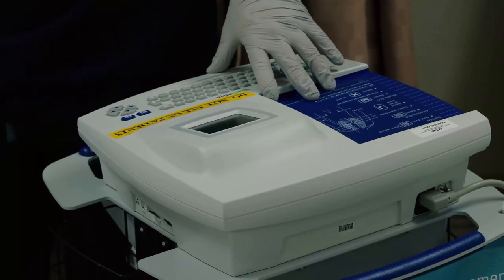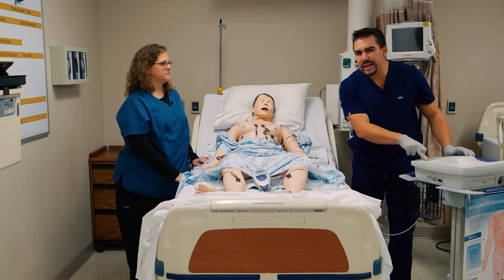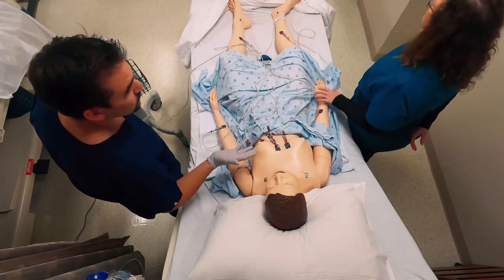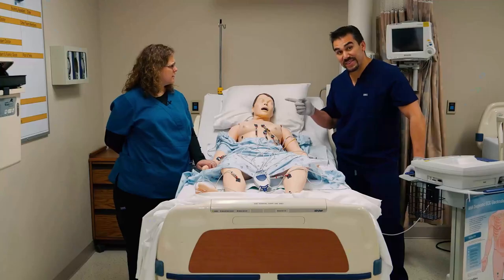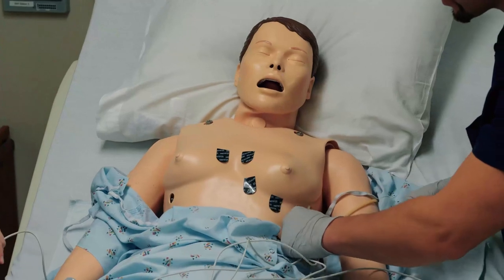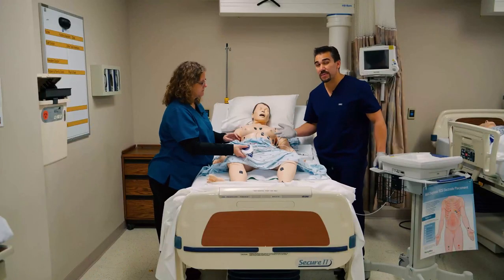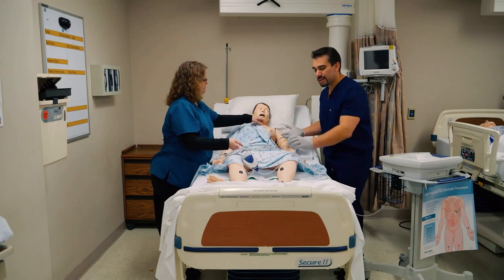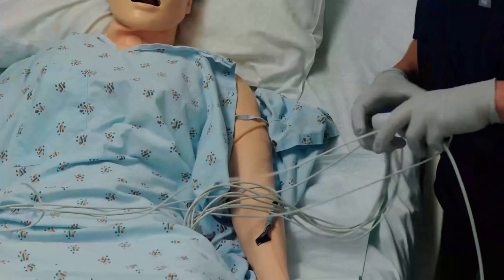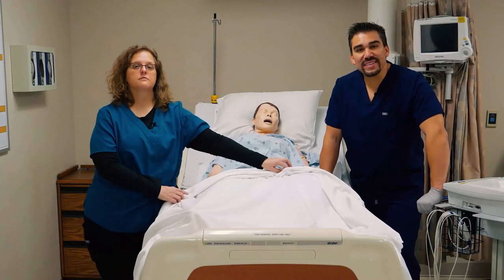Once everything is in place, tell the patient to take a big deep breath out and try to stay as still as possible. Depending on the machine, it takes three to ten seconds to get a good reading and then starts printing. Leave the EKG stickers on during the ER stay — the doctor will usually reorder the EKG later. When a patient comes in with an MI, we do multiple cardiac enzymes like troponin as well as multiple EKGs to see if the patient is getting better or worse. If going to surgery, it's just a quick cardiovascular check.